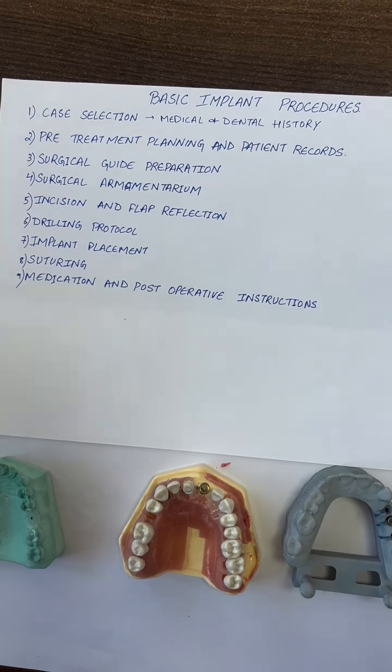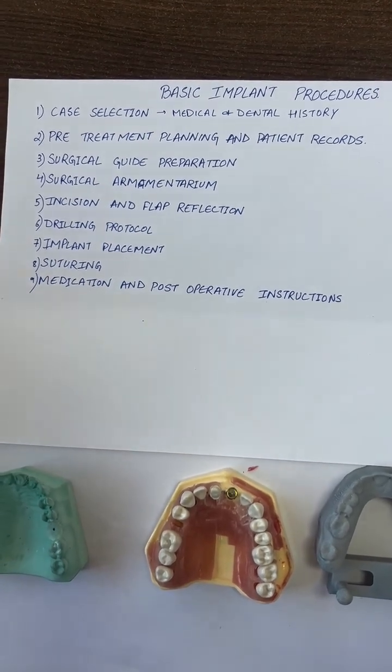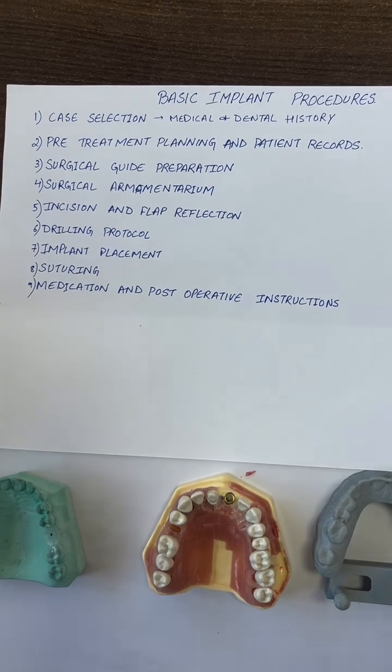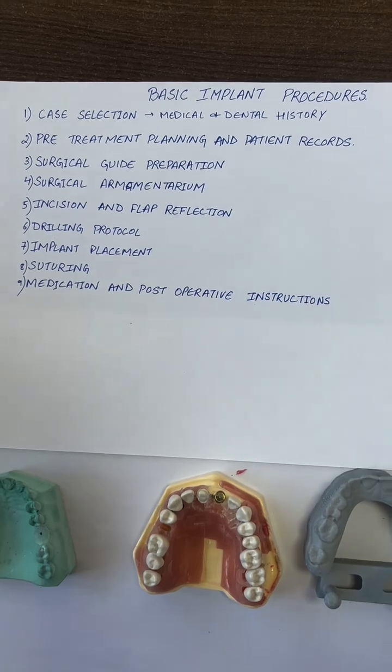In the radiographic examination, we should take intraoral radiographs. We should take the OPG radiographs, and the most important thing is we should have the CBCT scans.